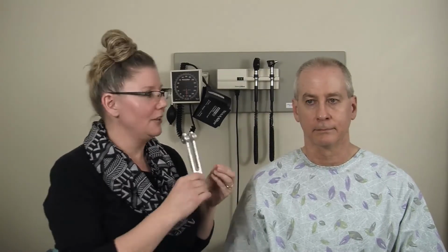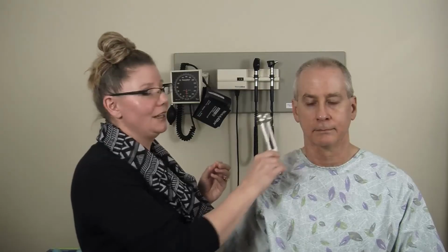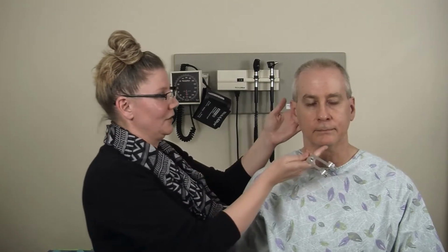The other type of advanced ENT hearing testing we do is the Rinne test. Again, we use a tuning fork. I'm going to strike it and place it on his mastoid process, and then ask him to tell me when he no longer hears it. I'm going to move it to the front of his ear, and he's going to tell me whether he hears it or not. I'm just going to turn you a little bit.